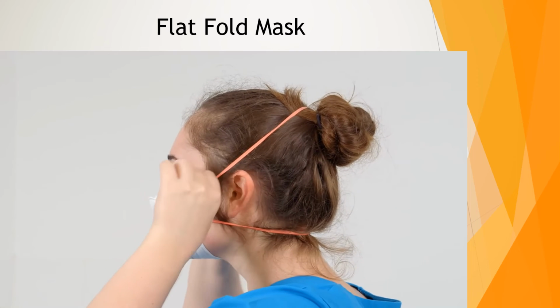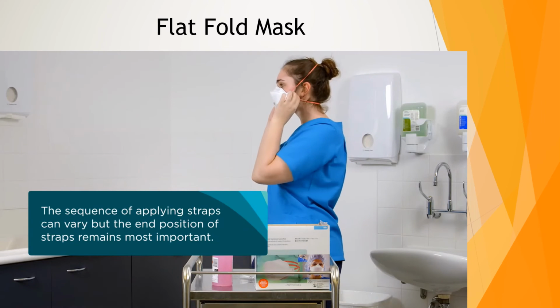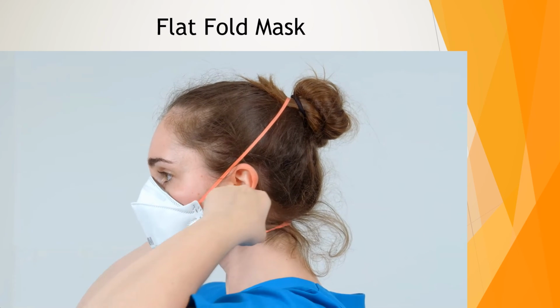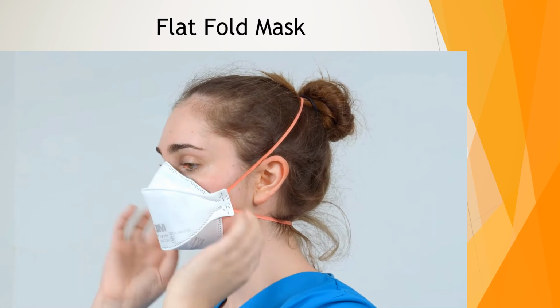Straps must not be twisted. The sequence of applying straps can vary, but the end position of straps remains most important. Adjust for a comfortable fit by pulling the top panel toward the bridge of your nose and the bottom panel under your chin.